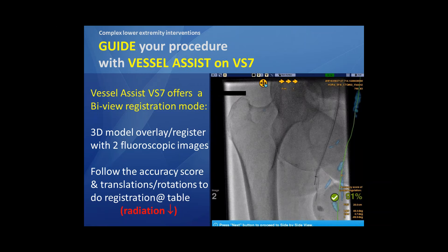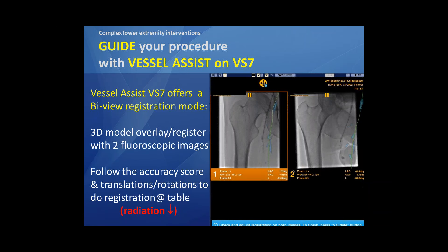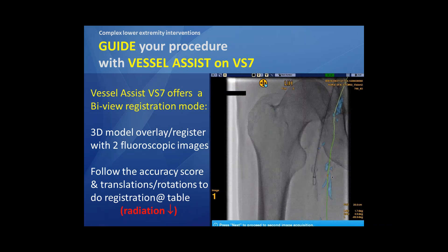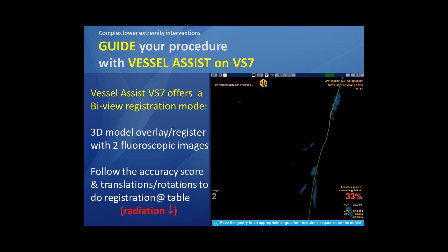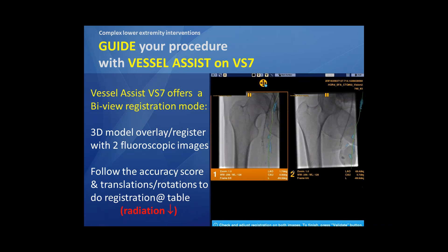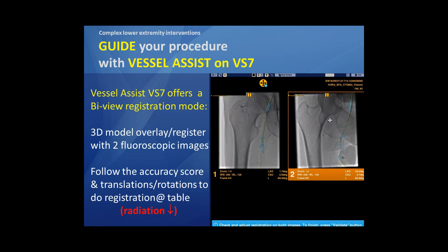Here you see this accuracy score. Once we have the first fluoroscopic image, you rotate and translate and create an LAO and RAO until you are in the green score. From the moment we reach 90%, it's green and it means that it's sufficient to create, in a perfect and accurate way, the 2D/3D fusion.